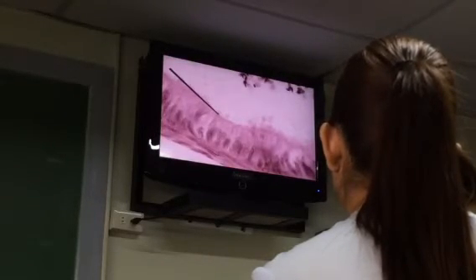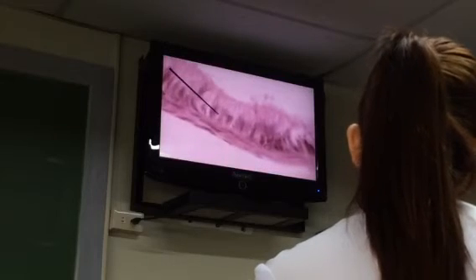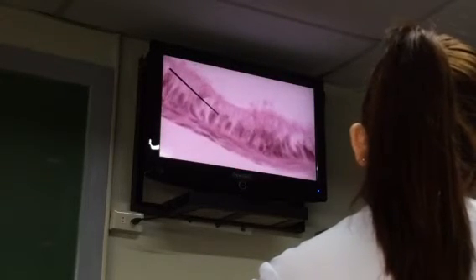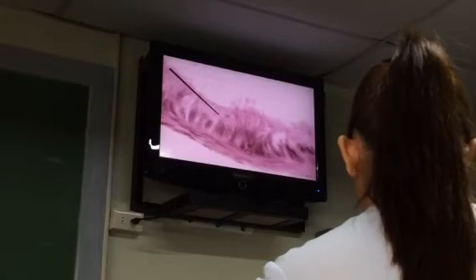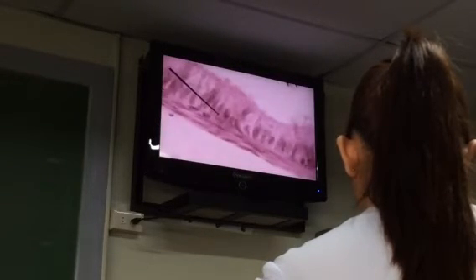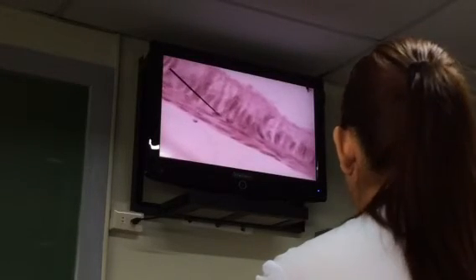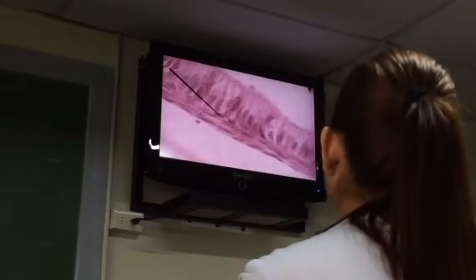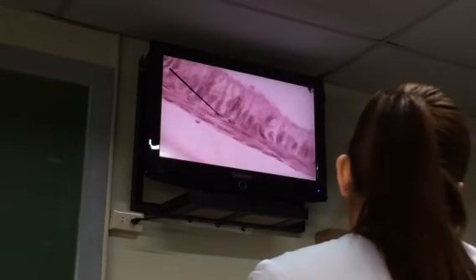And in the lecture, you'll find out that there are actually three kinds of cells here in your lining epithelium. The principal cell, which of course is your columnar cell. Then you're supposed to find your basal cells. Medyo difficult to see yan, basal cells. And of course, the so-called halo cell. Halo cell, if you remember, are what?